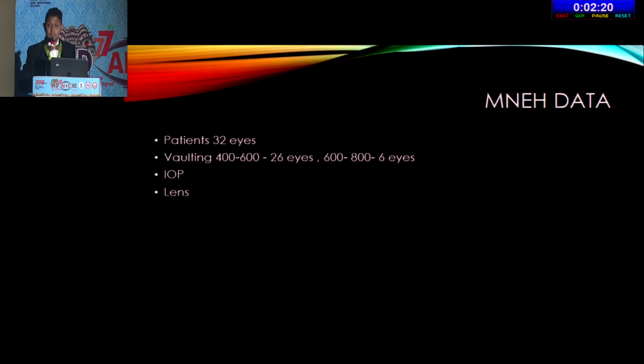For the lens status, we have had follow-up for around 4 to 5 years. It's pretty clear. There was one patient who was operated on by someone else around 10 to 15 years back who developed a cataract. Explanting it was as easy as explanting any other ICL, where the incision had to be only 2.8. There was a doubt whether we have to extend it to around 3 or 4. No, it was just 2.8.